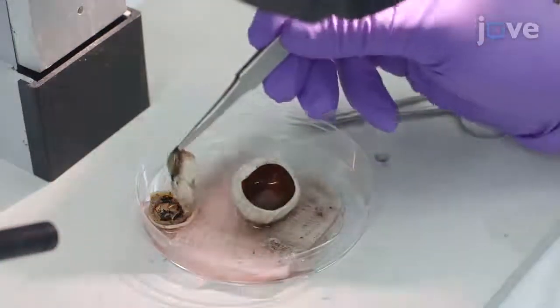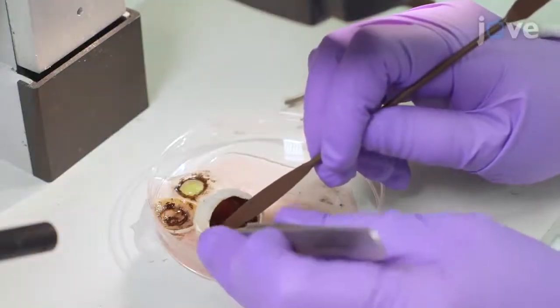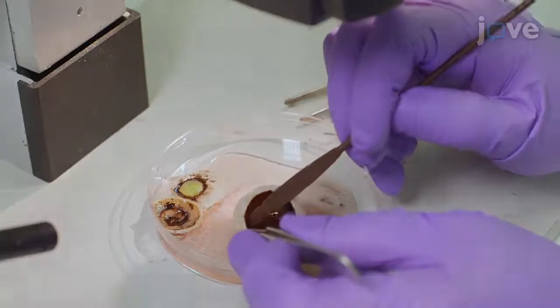Also discard the vitreous and retina. Then carefully peel the RPE-Bruch's membrane-choroid complex off the sclera from the periphery.